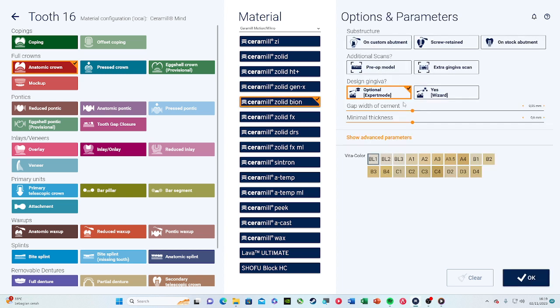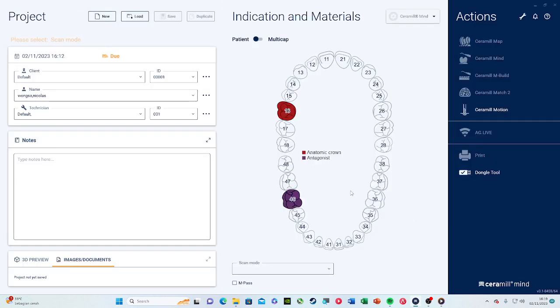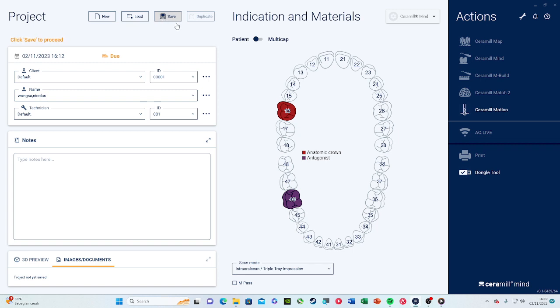Here you can also adjust the gap width of the cement and the minimal thickness of the crown itself. Then you choose the color — let's say we want to do an A2 color. Press OK, choose scan mode again, and press save. It will save the case.